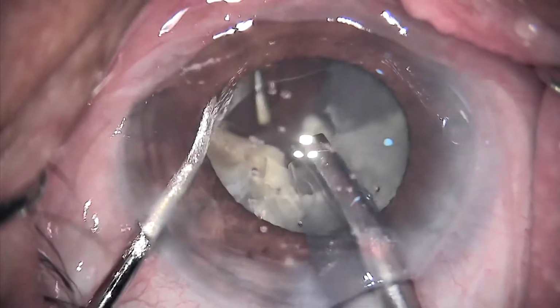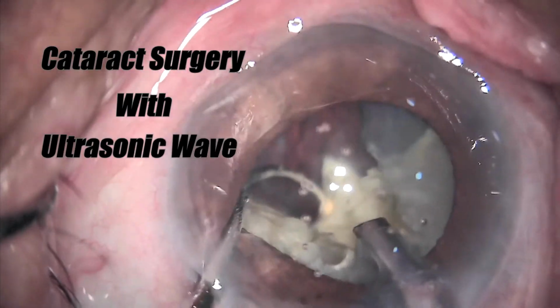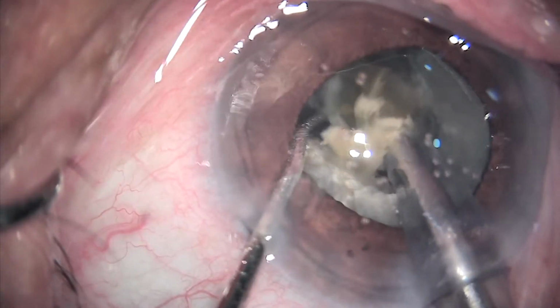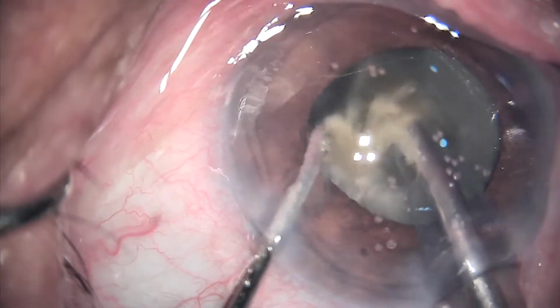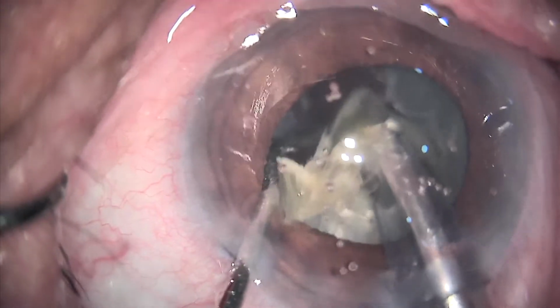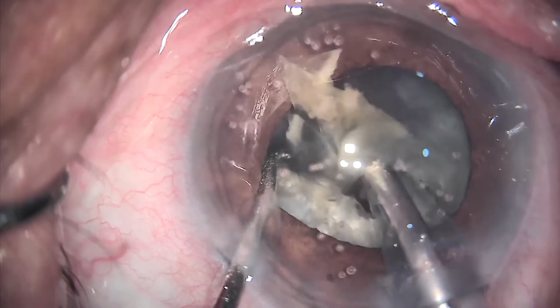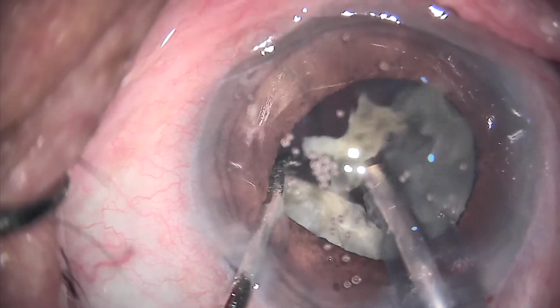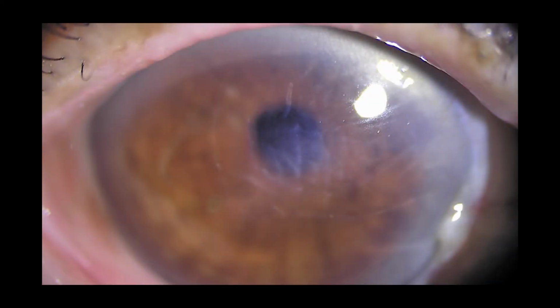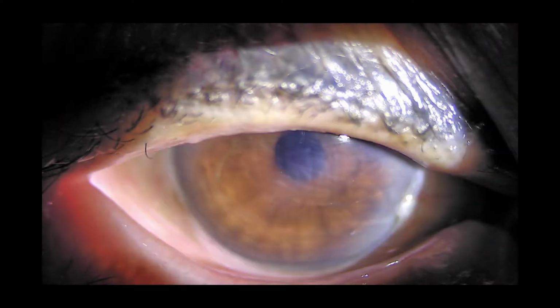Phacoemulsification is still being used, but posterior capsular rupture or severe damage to the corneal endothelium caused by ultrasound puts doctors who perform cataract surgery in a difficult condition. In the case of cataracts with severe nuclear sclerosis, the cornea is always swollen on the next day after phacoemulsification is performed. In addition, the recovery period is long. Thus, sometimes doctors encounter difficult situations.